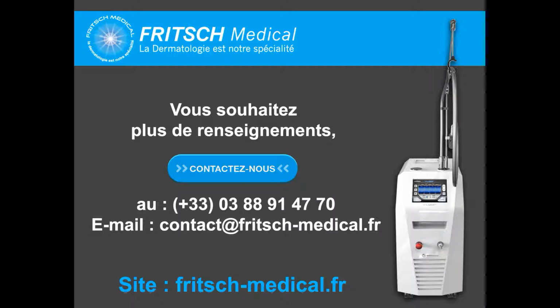But if you combine with the 1064, you go through the skin under the superficial disorder for remodeling or for skin tightening, to obtain a skin more firm, you know. So skin complexion and skin texture, if you combine the both. And for superficial skin rejuvenation, you can focus on dark spot, and you can treat all the area with a large pole of the KTP to reduce and to modify the complexion. And if you repeat the session, patient will have some skin more clear, you know, more brightened.